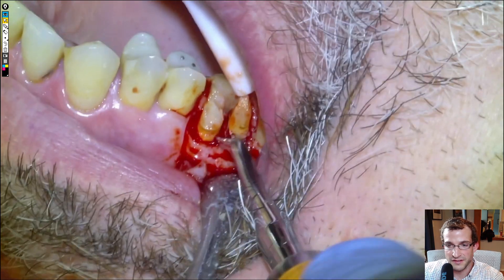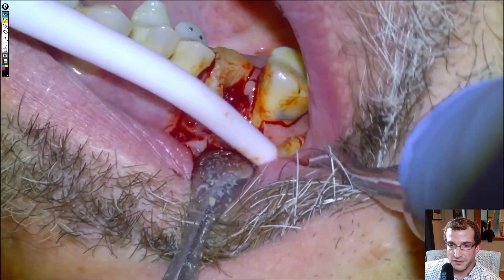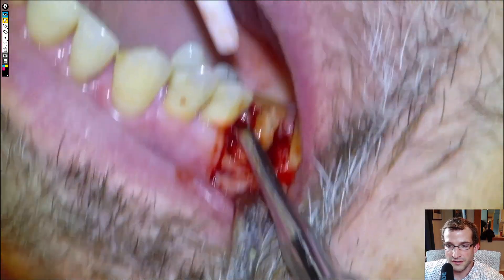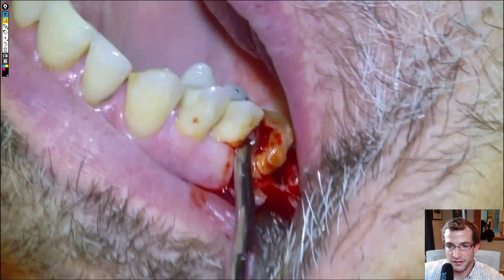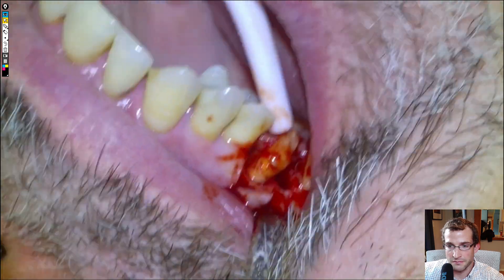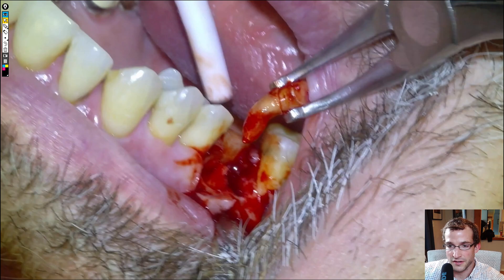We'll grab a 77R and wiggle the roots out individually — grab the distal and then the mesial. The mesial actually gets a little bit hung up because it turned out to have a bit of a wicked curve on it. So we'll actually have to grab some how pliers that were handy and pull it out. You can see the curve on it there that was preventing it from coming out. You can also see a little bit of GP poking out the root tip there, which is kind of cool.